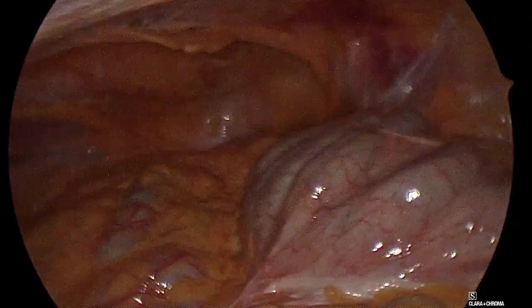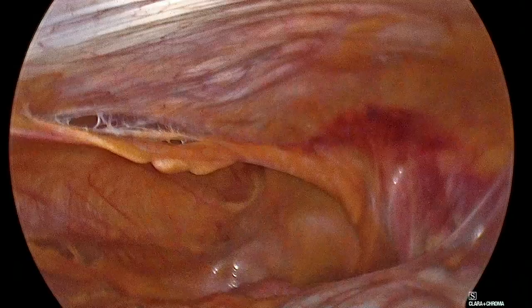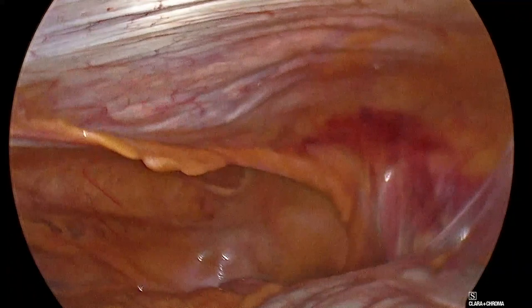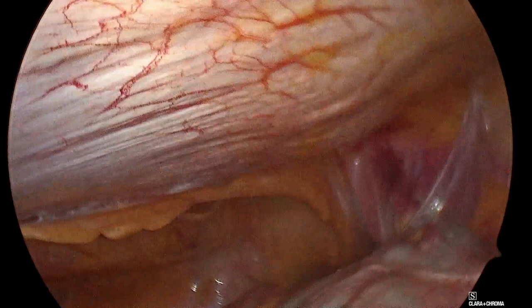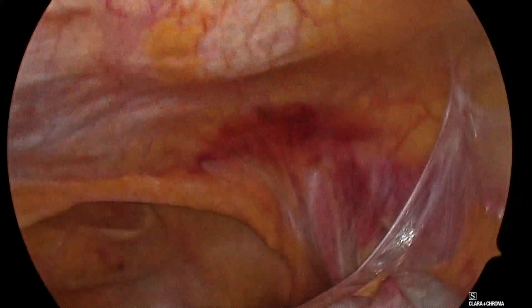So now that we're in, I want just to show you the pararectal line. So you see, this is the pubic bone, and the bladder is here. This is the rectus, this is the obliquus and the transverse, and this is right the pararectal line. Why is it important to enter at the pararectal line? Because down here, and I don't know if you can notice that, you see the epigastric. So you want to stay lateral to the epigastric. So, incision.